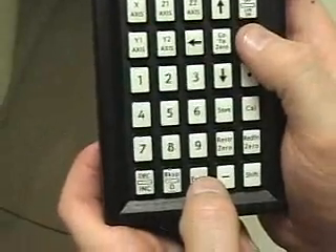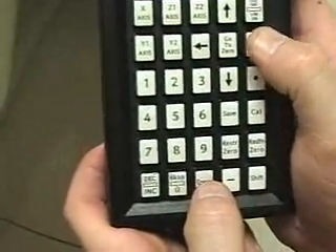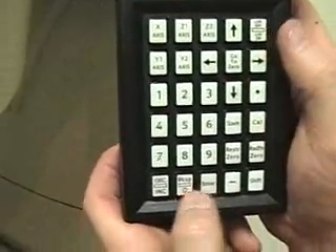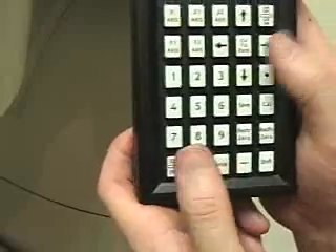And then you make the adjustment. I need to move this one up, so right arrow. Move it until you like it. Enter. And go on to the next.